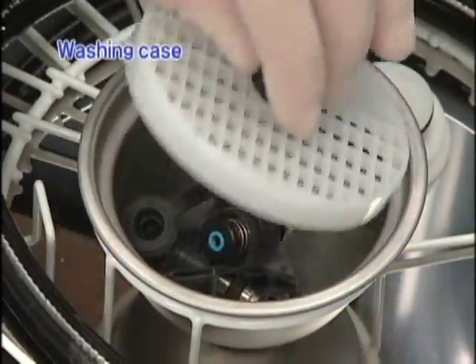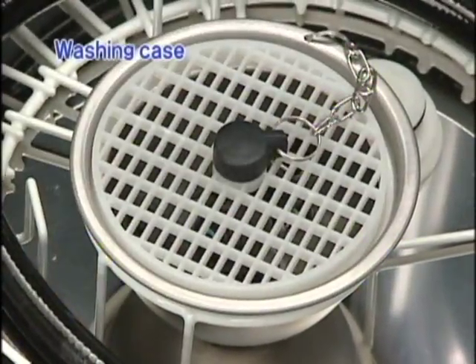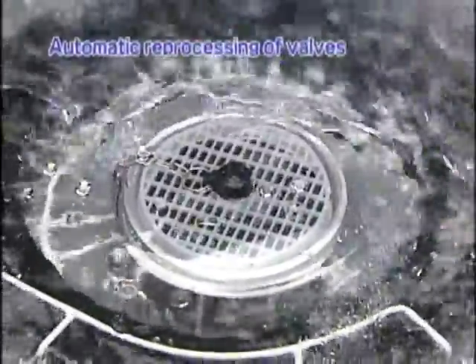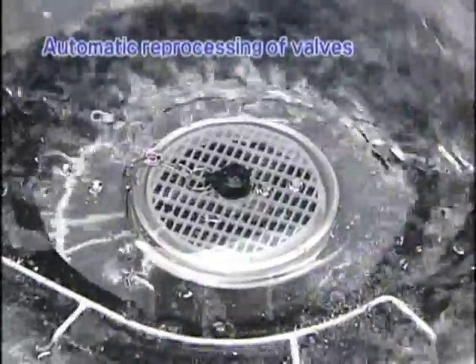The OER Pro also comes with a washing case designed for reprocessing the air water valve and biopsy valves. This handy case lets you reprocess valves and other small articles easily and reliably.